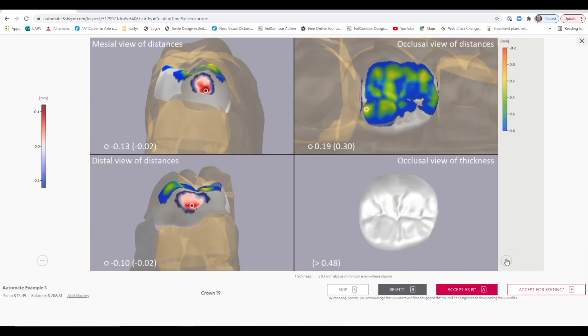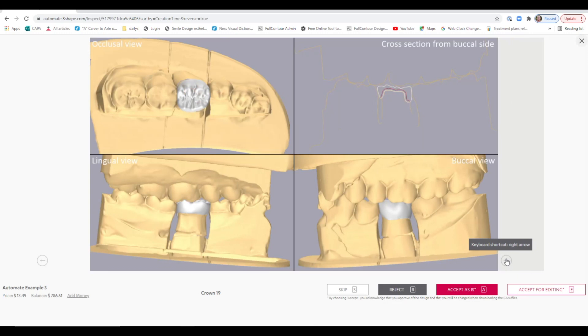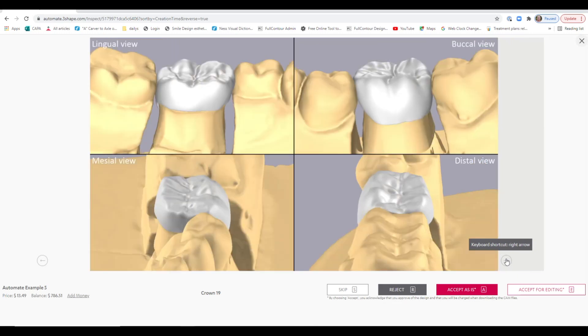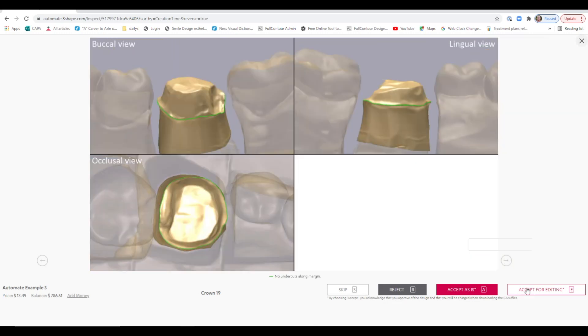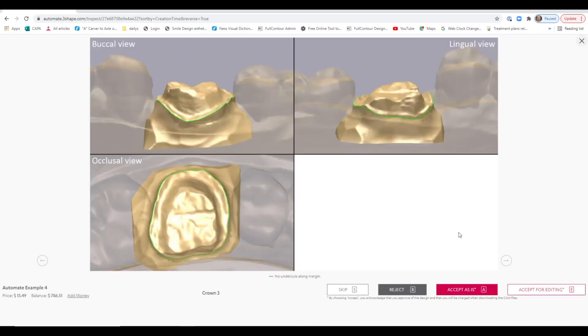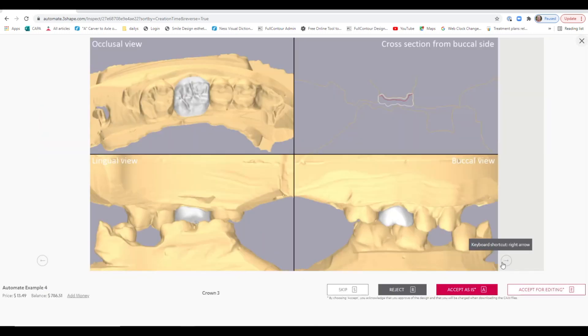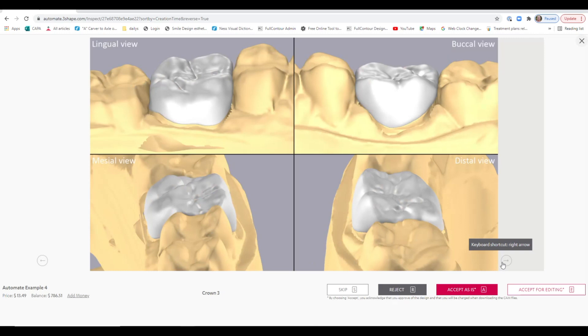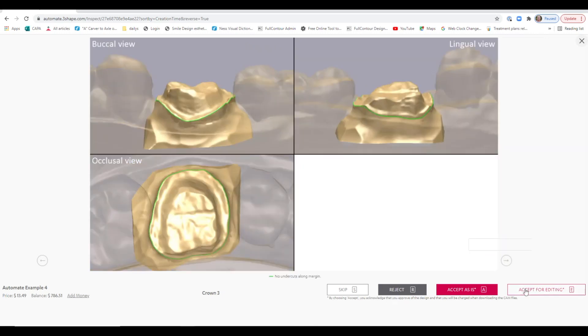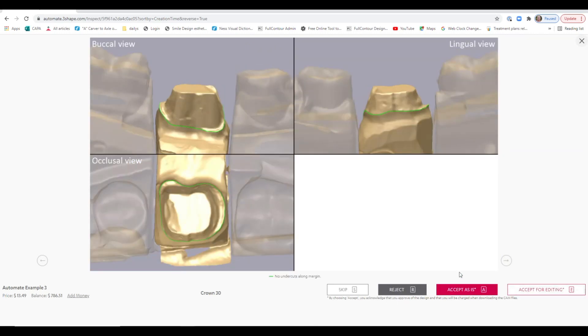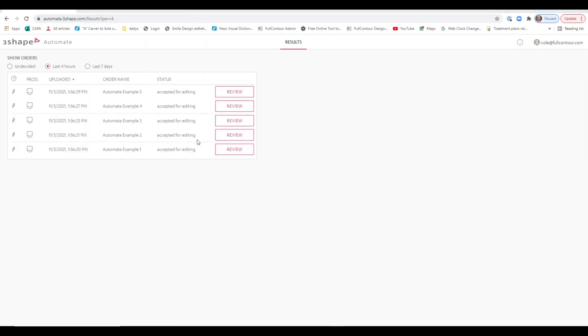Now you can go to your Automate view, look at the screenshots to make sure you like what you see. After the design is complete, you'll see the option to accept for editing.